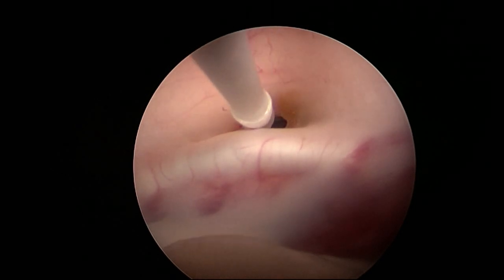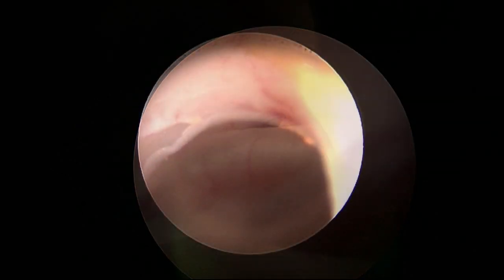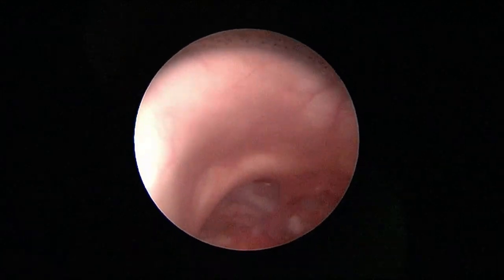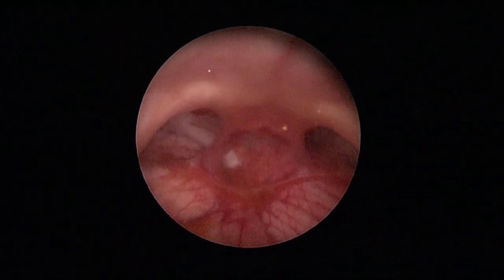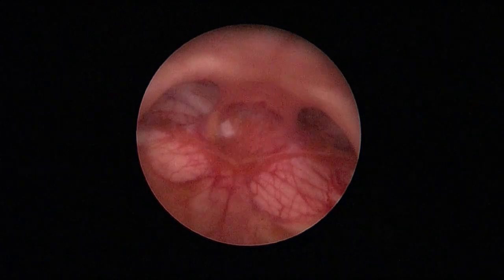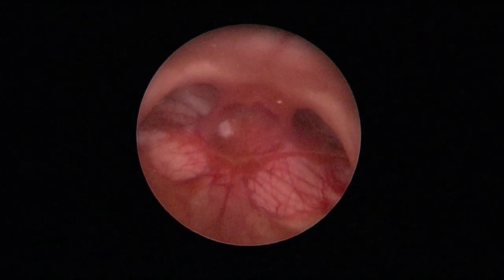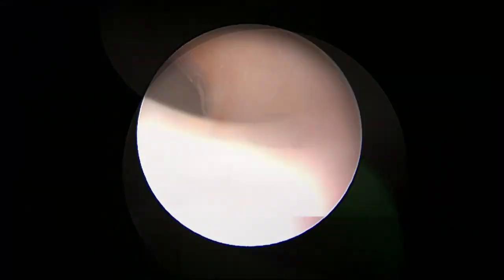In order to ensure that the fourth ventricle has been reached, the trans-aqueductal inspection of the fourth ventricle is performed with the 30 degree endoscope. In the depths one can see the choroid plexus and the closed foramina of the fourth ventricle.